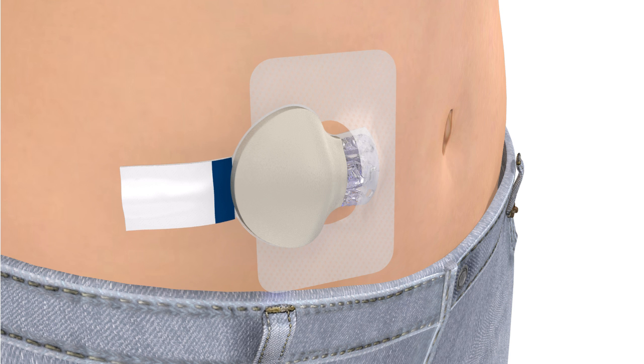Once the transmitter is connected, remove the paper backing from the adhesive tab. Fold the adhesive tab over and stick it onto the transmitter.